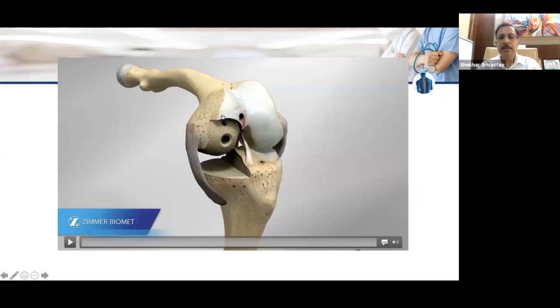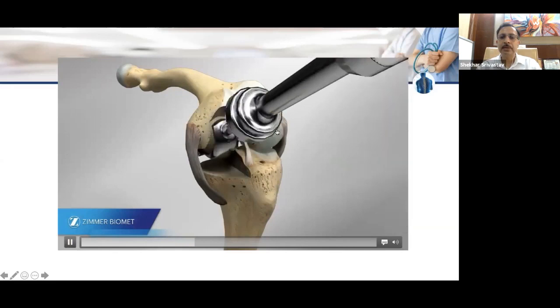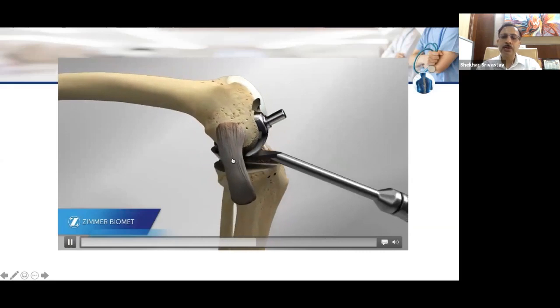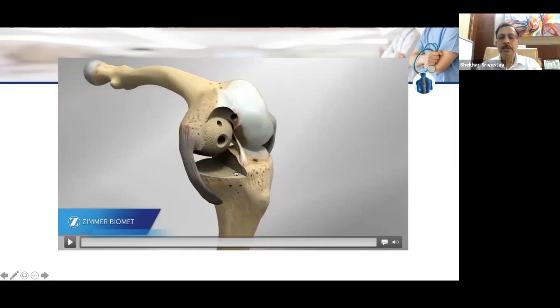Then you can see that there is this bone which is abruptly abutting the milled bone. So you have to remove this part, so you put this device to remove the impingement. Over that you ream it so that you get a gradual slope like this. Posteriorly also you use this special kind of chisel to remove the osteophytes. Now it's very important to remove all these bones because they may cause impingement and it will dislocate the spacer.